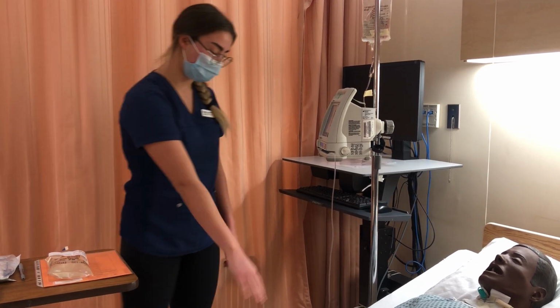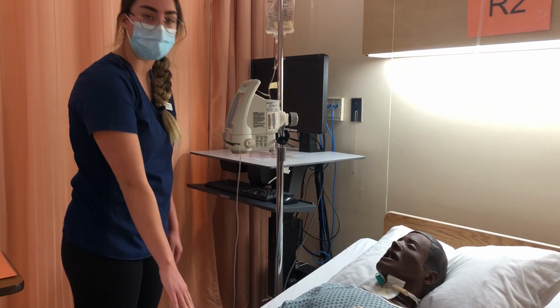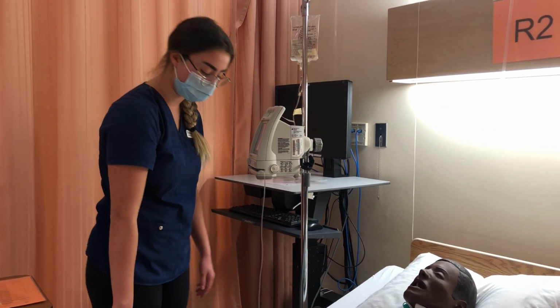I'm just going to check your site here. Is there any pain? They say no. There's no signs of infiltration or phlebitis, so I'm okay to use the site.